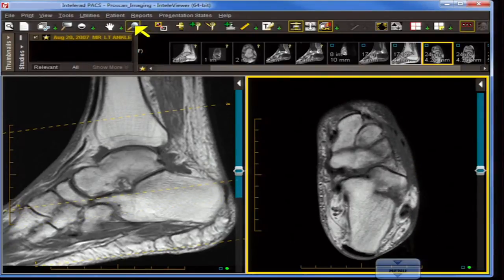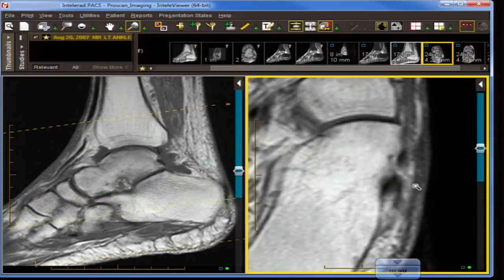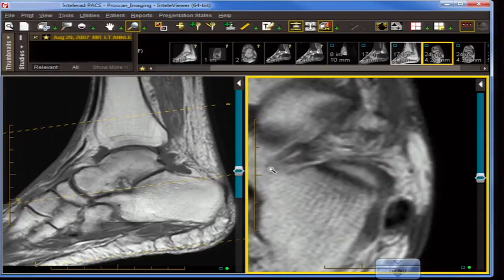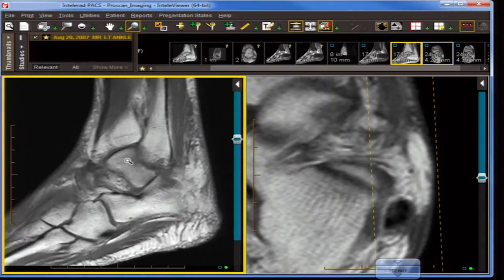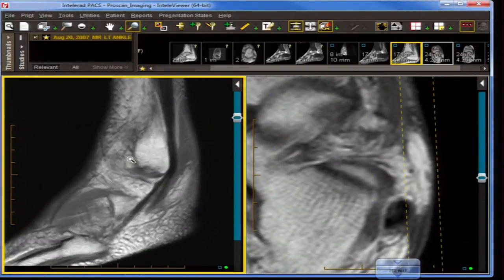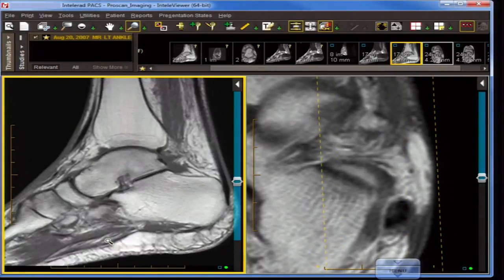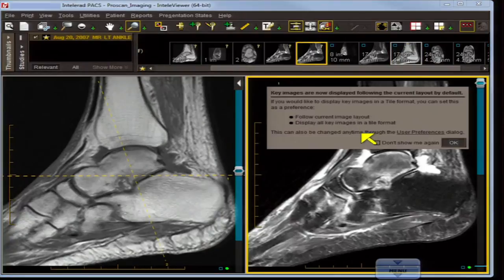Let's take a look at the peroneus brevis for a moment and identify it. You can see it pretty well there, and looking at it sagittally, here's the peroneus brevis going down to the base of the fifth metatarsal. Let's go back to our midline section.